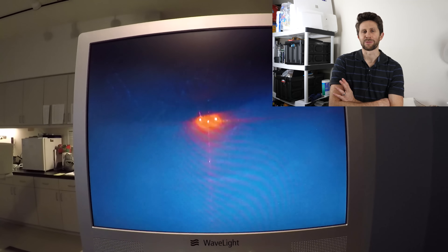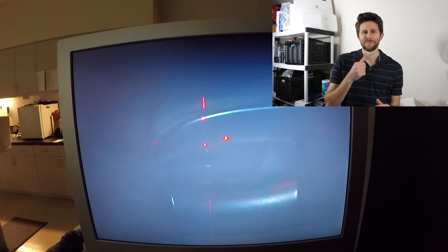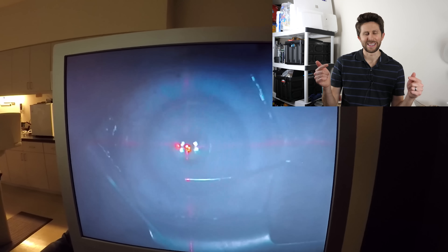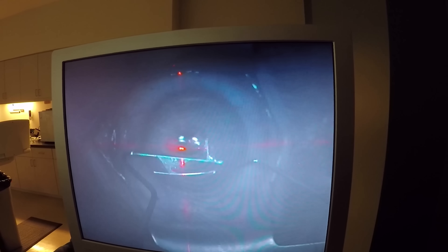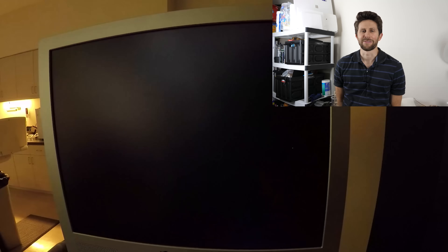During this, I didn't actually know what he was doing — I just felt pressure on my eye. It's really cool to see afterwards what's happening. Dr. Cornell was amazing — amazingly smooth hands. You can see that very thin flap getting pulled up. And this is the part where you can smell the vaporizing cornea.